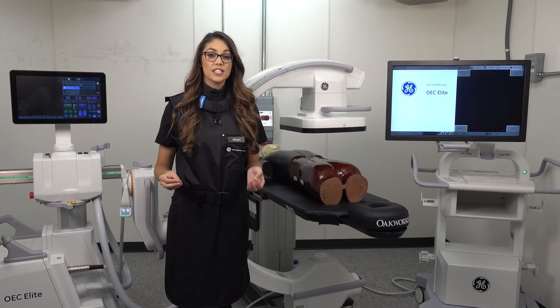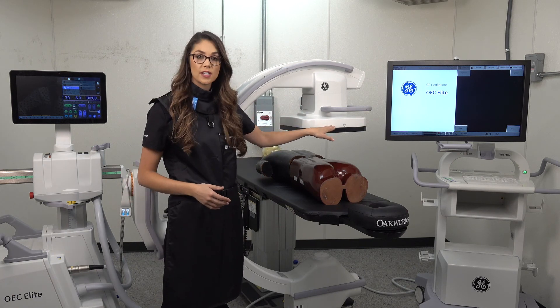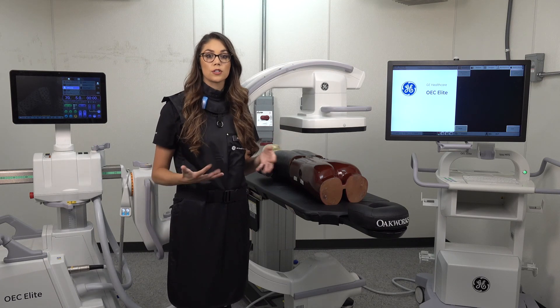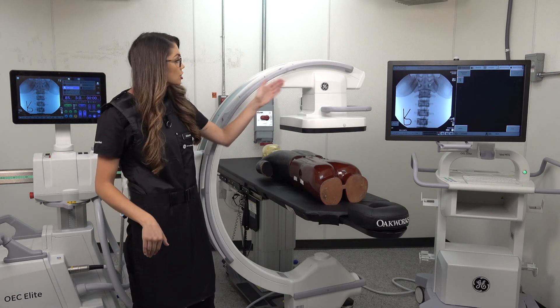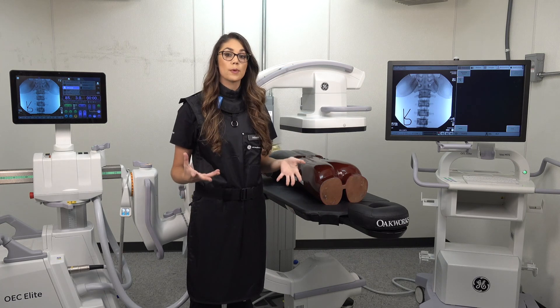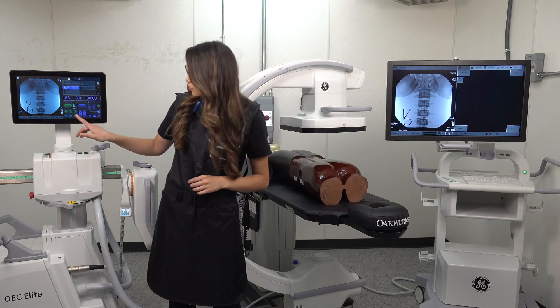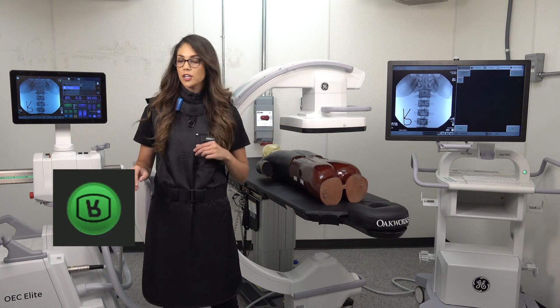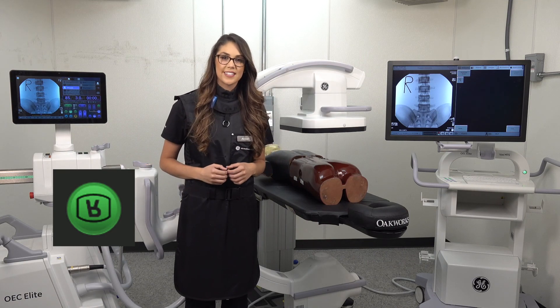Now for this procedure, our patient is facing prone, but their head is away from our smiley face indicator. We'll want to orient our image, but let's first take a picture and see where we're at. Just by looking at this picture, you can see that it is upside down, so we need to get it anatomically oriented. The way that we would do that is by going to our touch control panel and looking for the upside down R matching our indicator. Once that is selected, our image is now anatomically oriented.